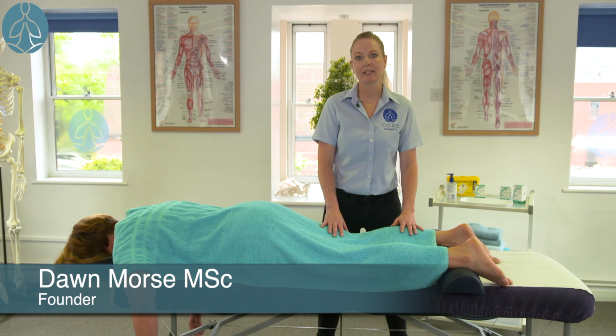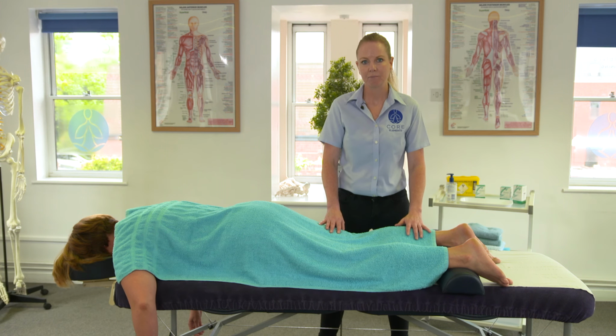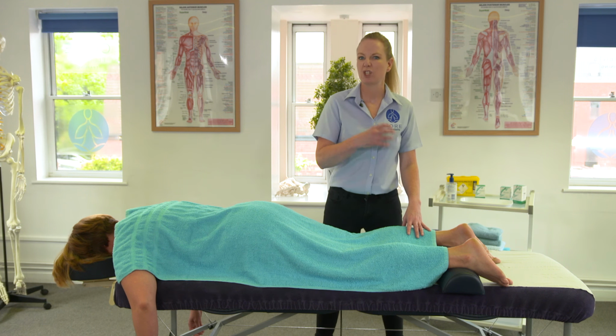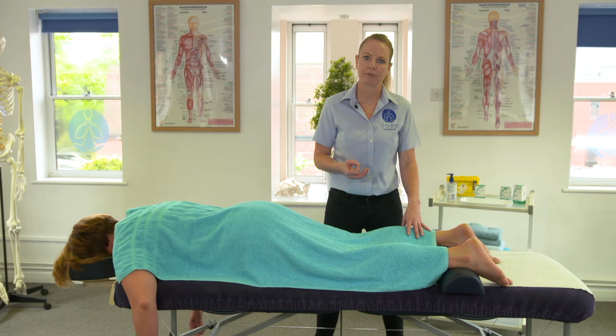In this video, I'm going to demonstrate dry needling to the gastrocnemius and soleus muscles in the generalised calf area of the lower leg. This is a really useful technique for clients that might be suffering with generalised calf pain or cramping on physical activity, or even cramping when they're sitting for long periods of time.